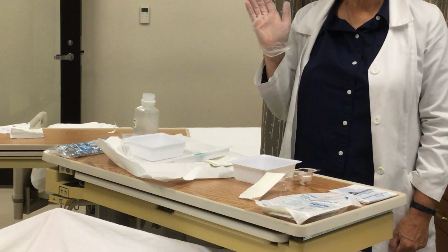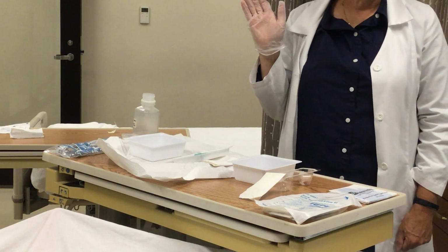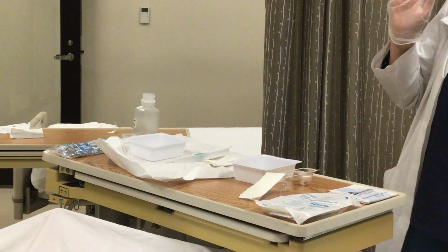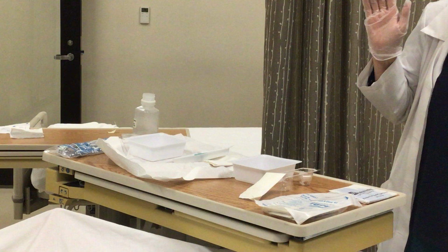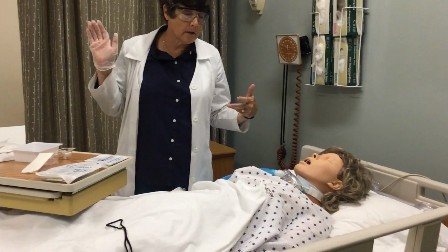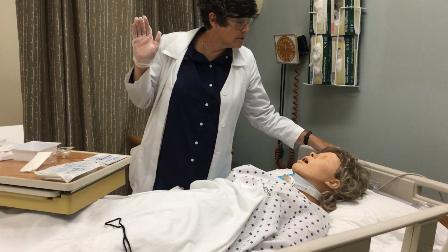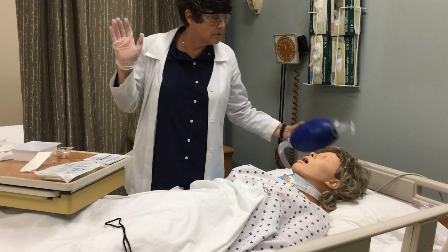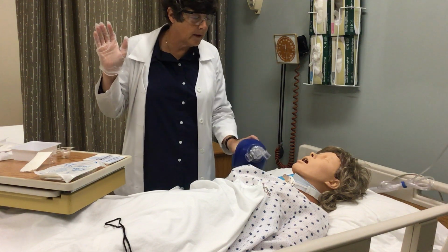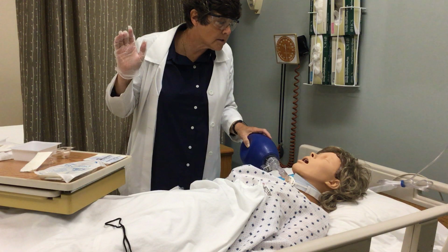If the patient was on an oxygen device, hyperoxygenate the patient. You can either take the patient's trach collar, place it over the patient's tracheostomy tube, and have them take several deep breaths. If you are in a position where you need to provide oxygen to your patient, you can use an ambu bag. This little piece here fits over the tracheostomy tube.